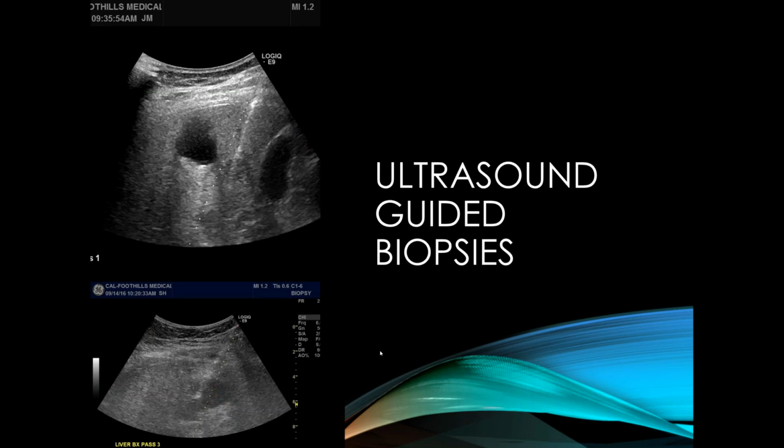The biggest thing with ultrasound that is very helpful for neuroendocrine tumor is basically guiding biopsies. The reason being is that we want to put a needle into that liver lesion, and you want to make sure that the path of that needle is going through nothing important. So we do ultrasound guided biopsies, and this is routinely done, and it helps us to basically differentiate ultimately what that liver lesion is.